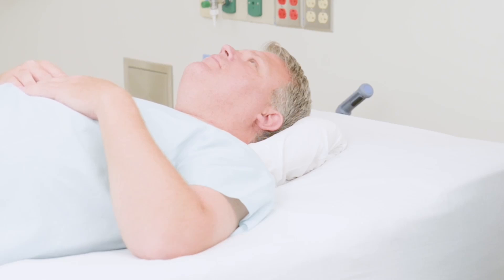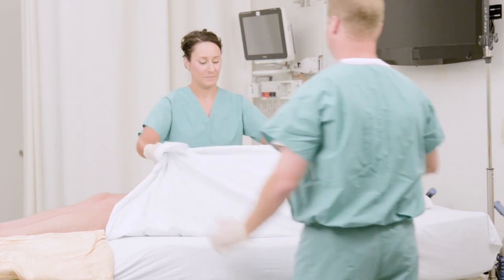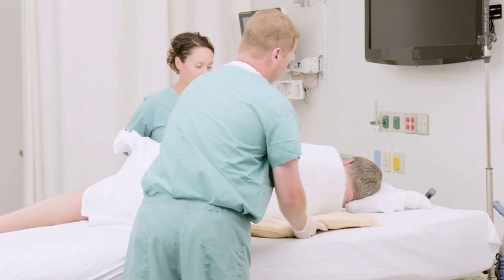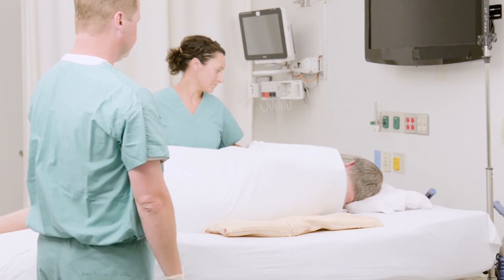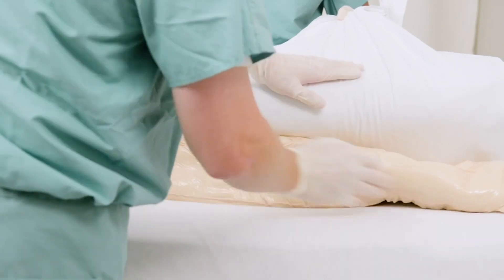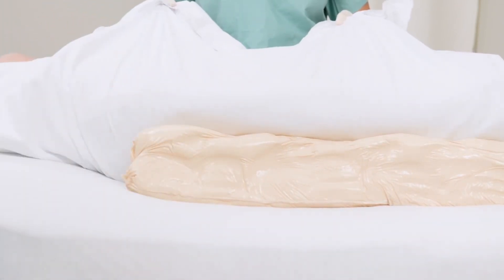Now we need to get the rest of the body in alignment using the medium or large utility positioners. Using the draw sheet, turn your patient toward the desired side. Start with the positioner flat and place it between the shoulders and hips of the patient. Have the patient lean back into the positioner, then use the flat part of your hand to mold the positioner to the curvatures of the body using three to four smooth movements until the desired degree of turn is achieved.